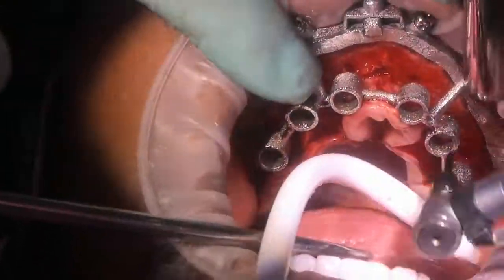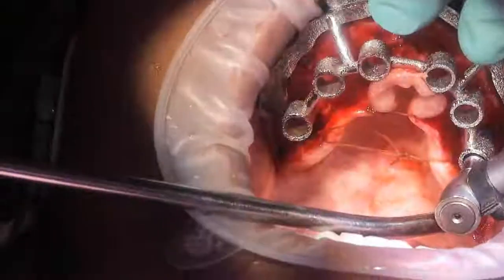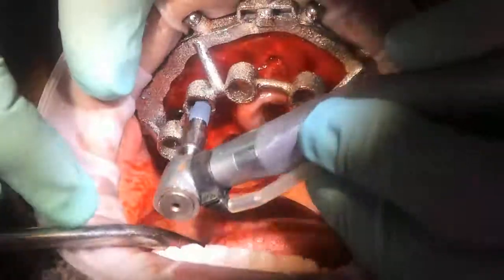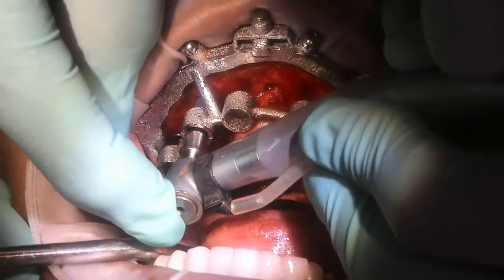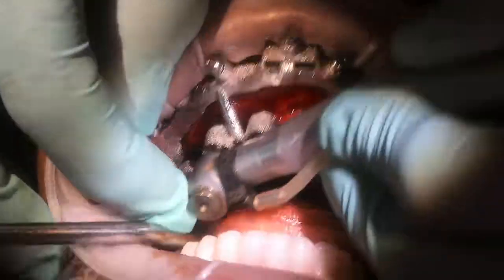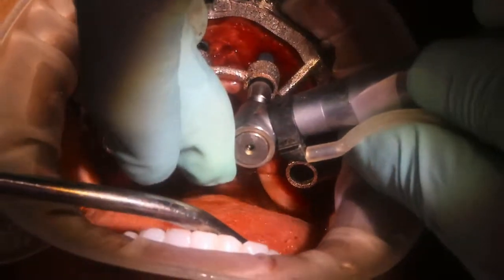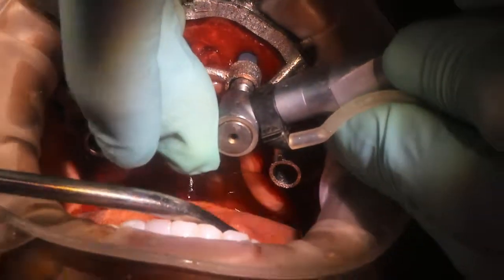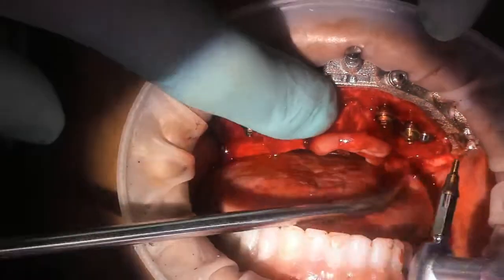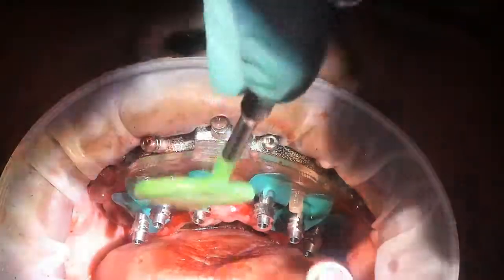Then the osteotomy guide is seated and all the sites are drilled as normal chrome protocol. And the implants are placed, and just like many systems, this system allows the implant to be placed through the surgical guide. Once the implants have been placed, the carrier guide is reinserted and the multi-unit abutments are placed, as well as the temporary cylinders. In this case, the doctor used impression posts.